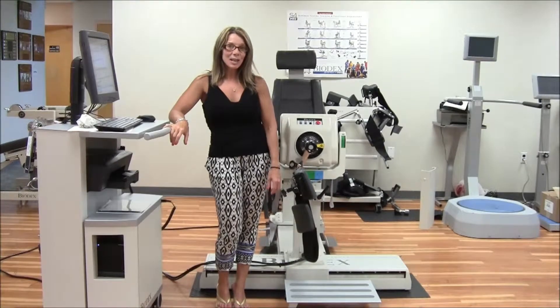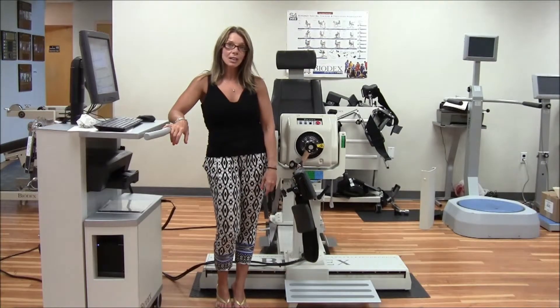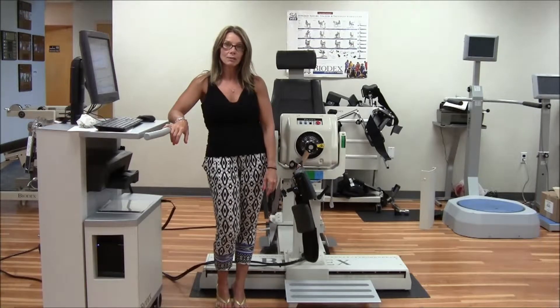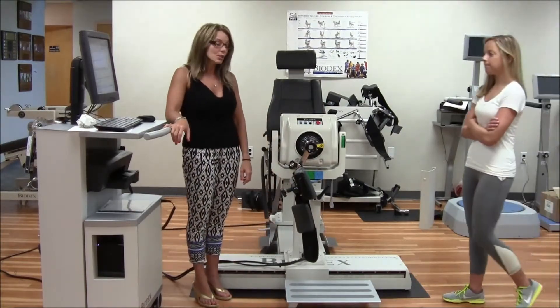Hi, I'm Natalie Thompson. And today I'm going to show you how to set up and use the pediatric hip attachment. The pediatric hip attachment not only can be used for children, but it can be for smaller adults, male and female. Megan will be demonstrating hip flexion and extension.